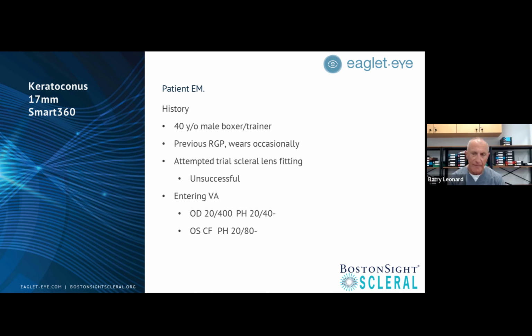He wasn't happy. He's a very particular person, which you wouldn't think in this boxer guy, but he's very, very particular about his vision, his eye health, and that. So he hunted me down and came in and said, I want to see perfect, and I want to see 20/20. So we all know when we get those challenges, we always rise to the occasion. So we fit him. We used the Eaglet, got some really nice scans.